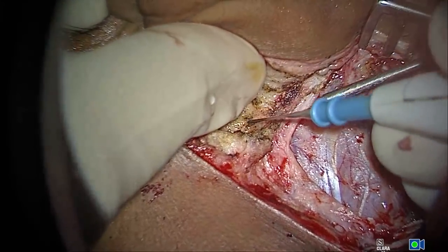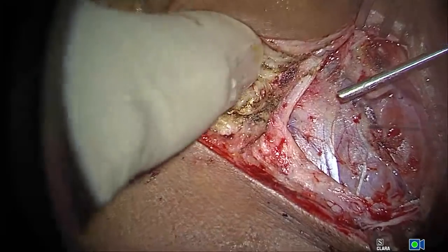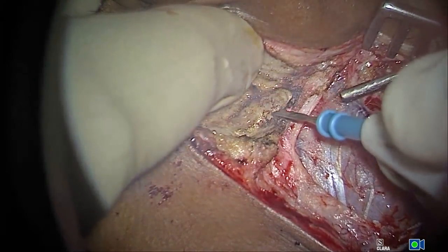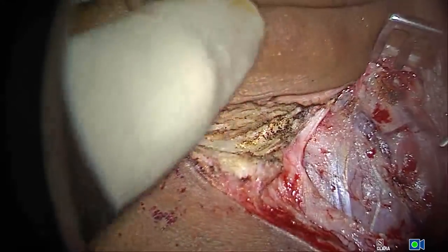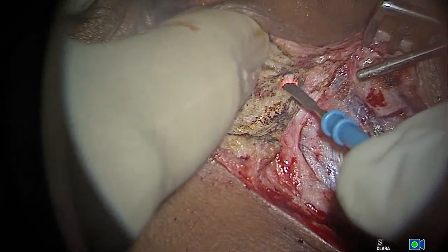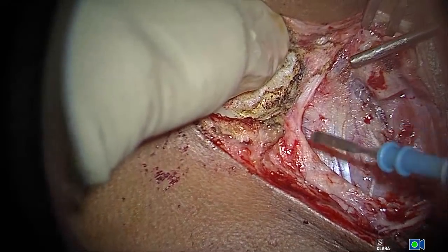So that is it. Now we are trying to get that incision anterior. Until where should you get that incision? You should get it till the 12 o'clock position. That is very important. To get this incision till the level of the 12 o'clock position, that is the most important thing.